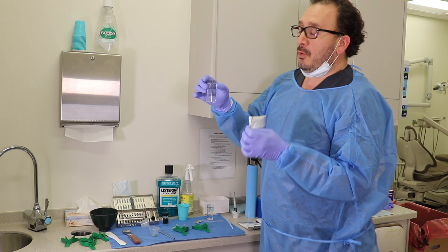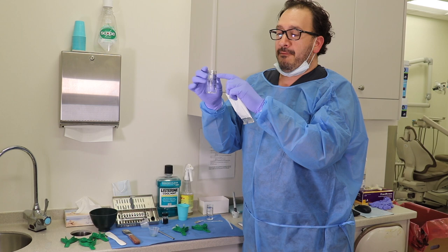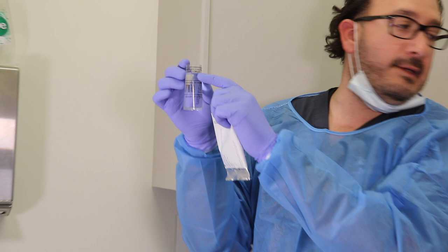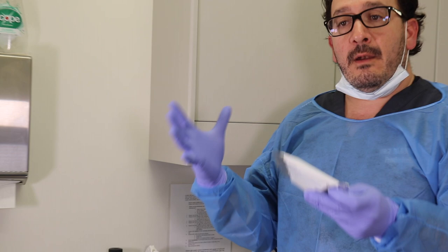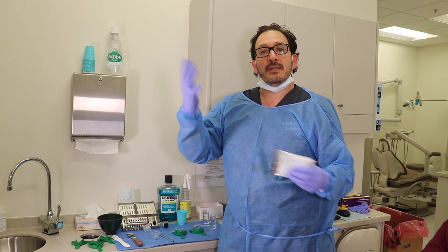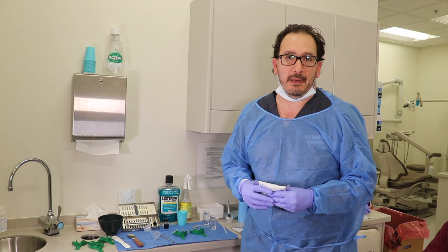What I want to do, because we've been taking impressions for so long, we want to have the water just below where it says powder. That means it's almost two and three quarters or two thirds of water. We're not going all the way up, because the more water we put in the mixture, the more runny we'll get this mixture. And because we're taking impressions in a patient's mouth, we don't want that alginate running or being very flowable and probably going to the throat of the patient or something like that. So we're gonna make it a thick mixture.